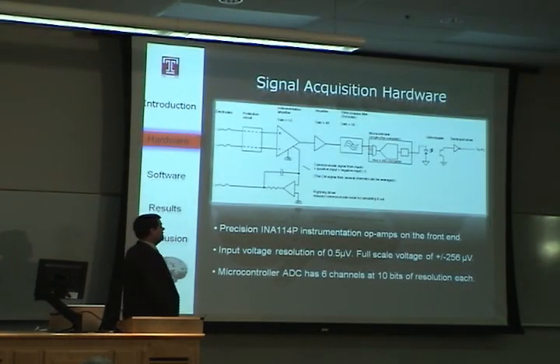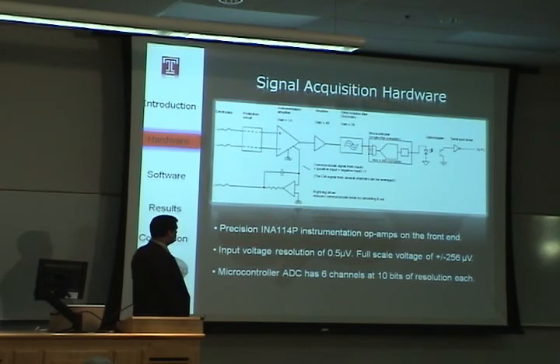Now, this is a block diagram of the Open EEG system. This shows 2 channels coming in at the electrodes here. The signal first goes into an initial amplification stage, where it is then passed to a second amplification stage before going through a low-pass filter, which removes any 60 Hz AC noise that can get coming through the electrodes. From the amplification stages, it's passed on to the microcontroller, where it is acquired, and sent into the serial line, where it's finally sent to the user's computer.